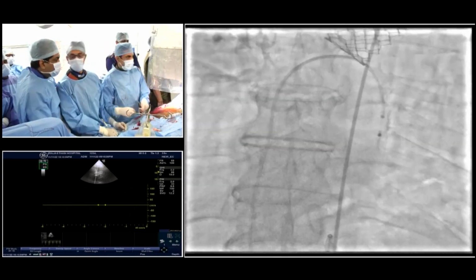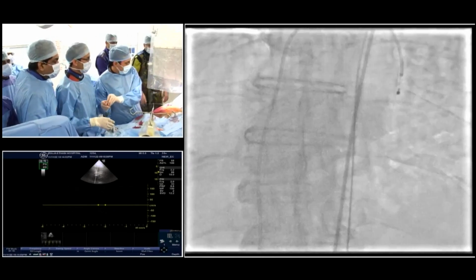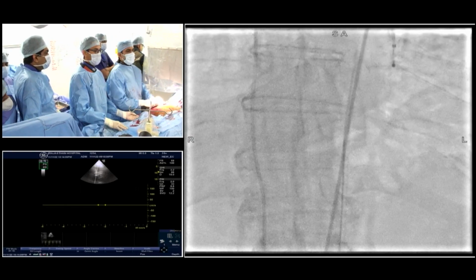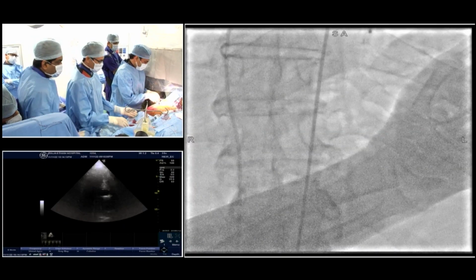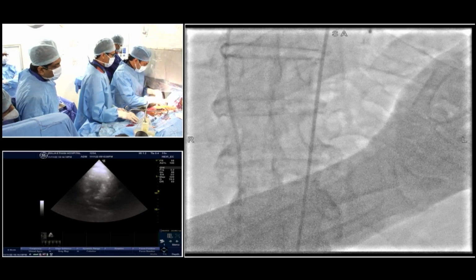If we can stick to one dilatation, and if that includes the valve deployment, that's the most logical reason, because you don't get pre-dilatation, post-dilatation, and the valve with the balloon expandable. The reason post-dilatation causes stroke is that now you have a stent frame and calcium. When you are dilating it, there is a chance that the calcium may break up and go above. In a pre-dilatation, you don't have that.